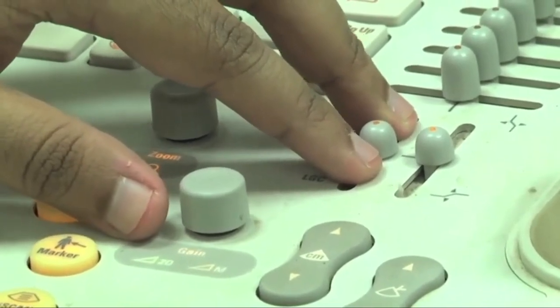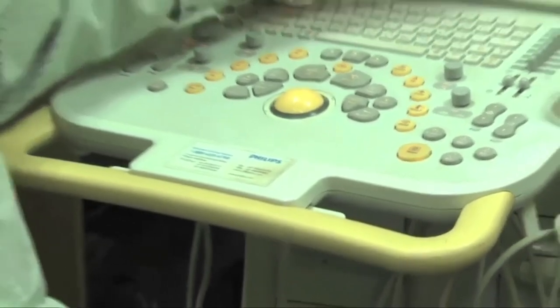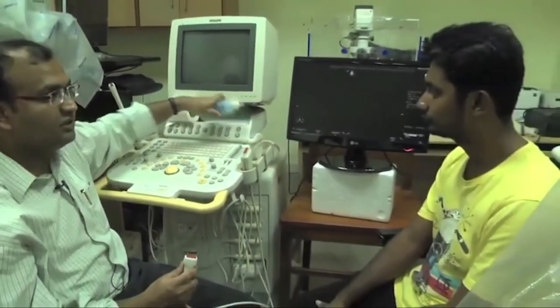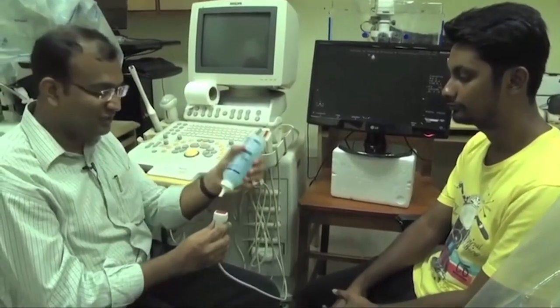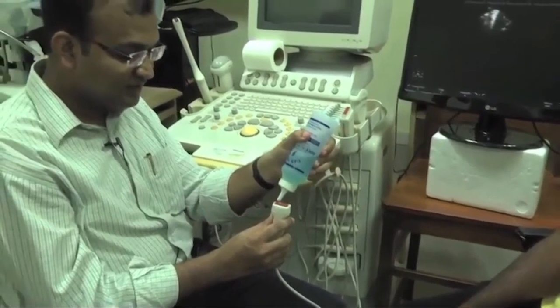Now, without taking much time, what I would try to show is one of these probes and how we are doing. We have our volunteer over here, Devargo, who is interestingly doing his PhD also on ultrasound, and today we are going to perform an ultrasound on him. He has volunteered to have his carotid imaged.